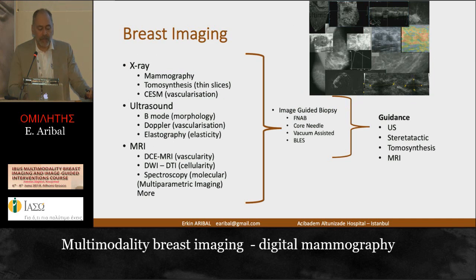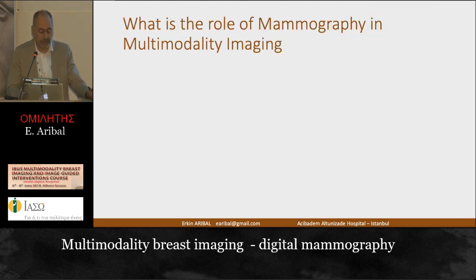Breast imaging has three main imaging systems: X-ray, ultrasound, and MRI, and they have different modalities or different advantages. We can also use image-guided biopsies under these modalities. So we have a lot of options when we have a diagnostic or screening patient.